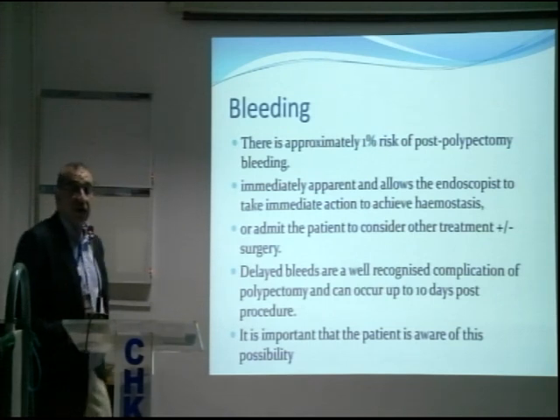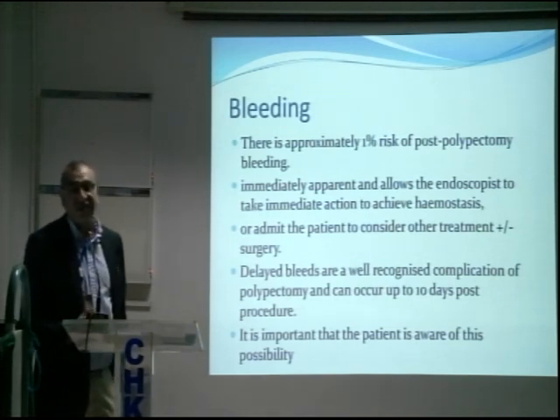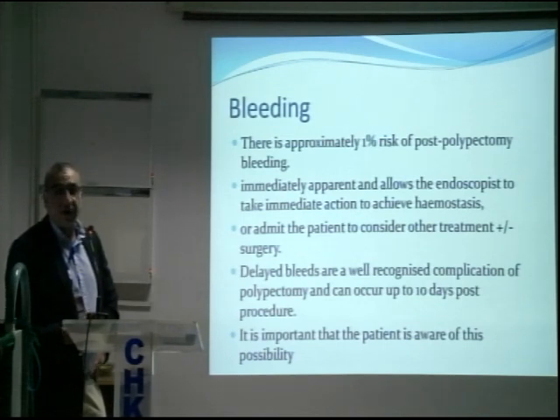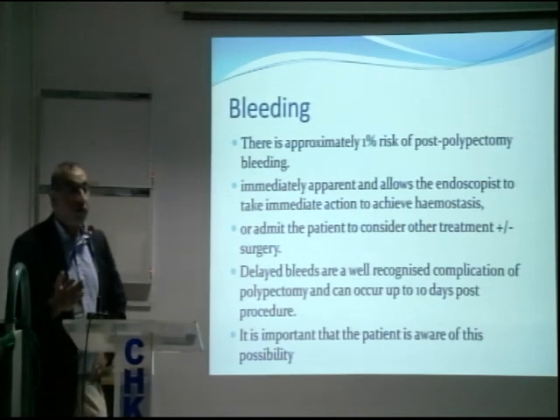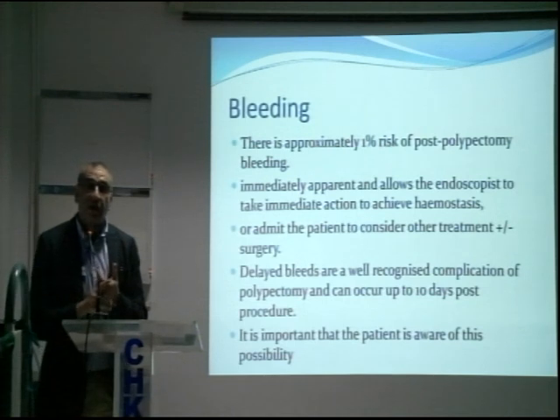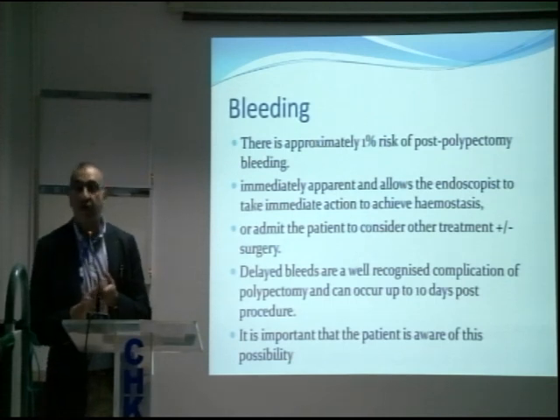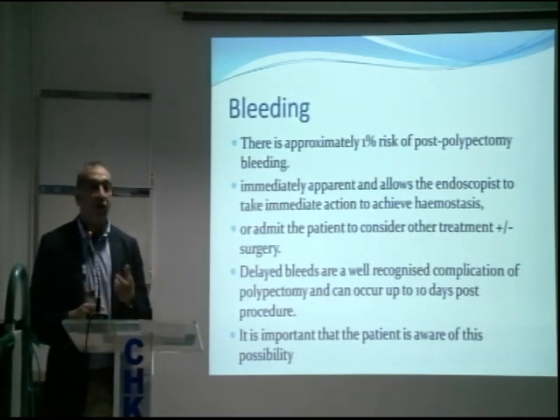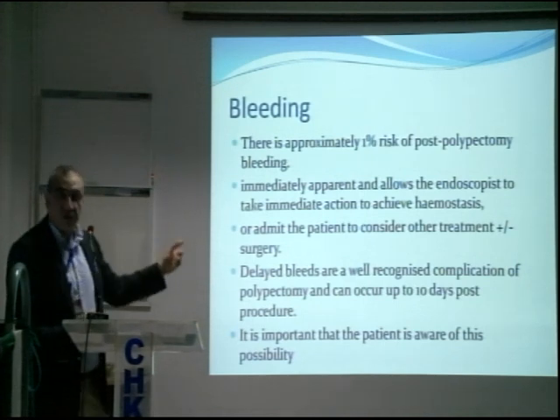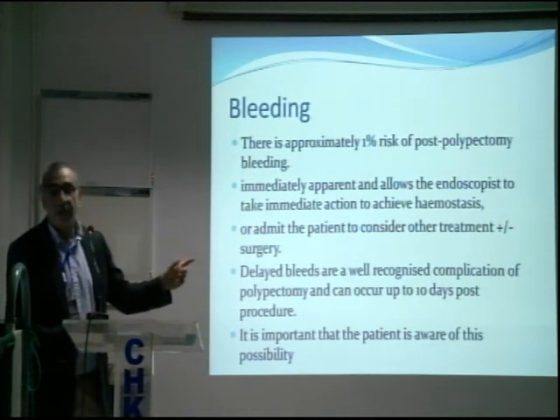Right. Risk of bleeding is, as I said, general risk is about 1 in 500, but after polypectomy, it can be 1 in 250, 1%, 1 in 100. So for a major polypectomy, it is relatively high, and we are all aware of that. And when you carry out a procedure like polypectomy, especially if you are removing a big polyp, number one, you should be aware whether you are up to doing it. Like if you are a featherweight boxer, you don't go out and fight with a heavyweight boxer, because he'll knock you out. So box within your weight. Do not box above your weight. So if you are only capable of doing diagnostic colonoscopies, leave polypectomies to your senior colleagues.